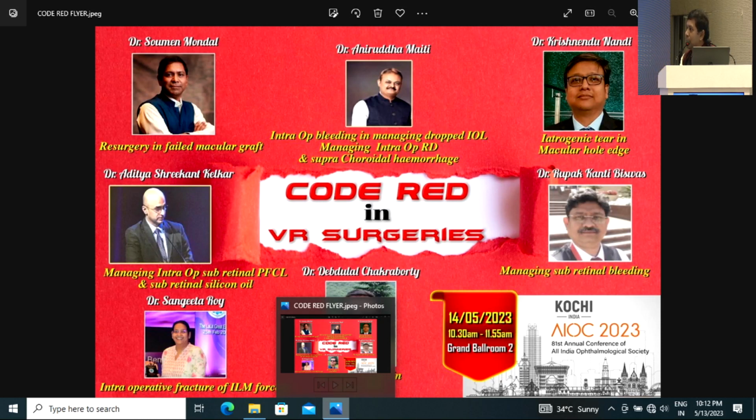Any particular reason you have put silicone oil instead of gas in this case? Well, that was my first case which I was trying for macular hole. I wanted to be sure I don't land up with a retinal hole or retinal detachment later on. Later on, I started using gas, but in spite of that, out of about 18 to 20 cases, I've landed up with an RD with a bad PVR in one case.